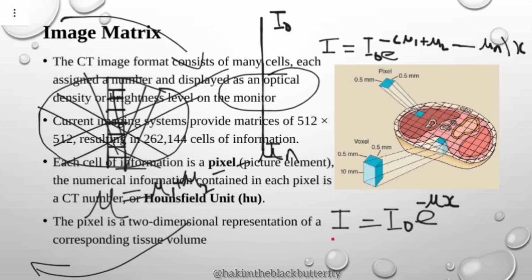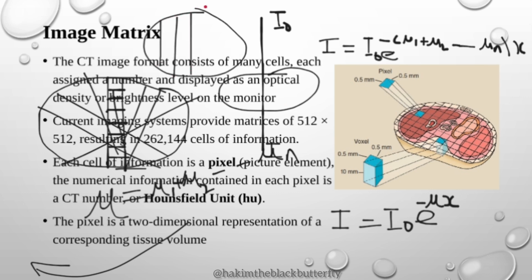To be very accurate, the CT uses fast Fourier transform equations to calculate. Our anatomy is going to be divided into a number of pixels.